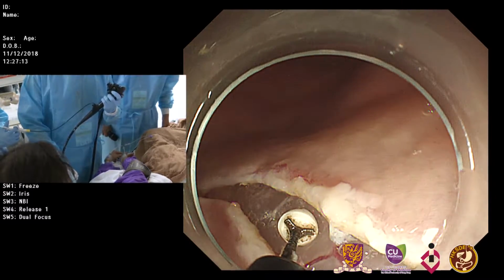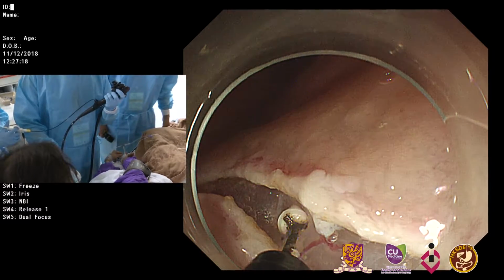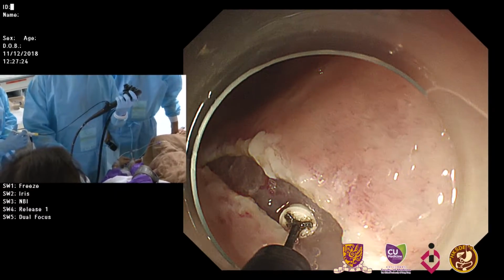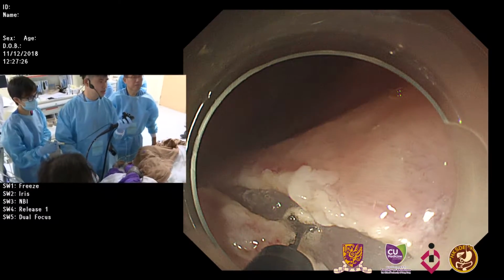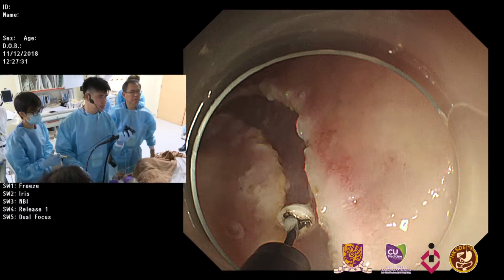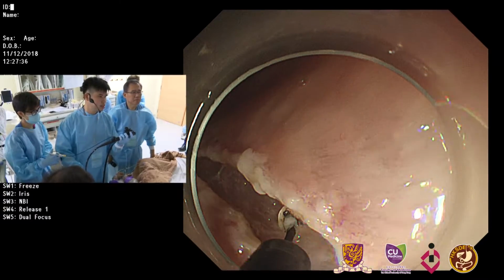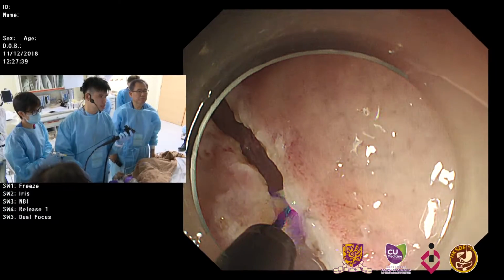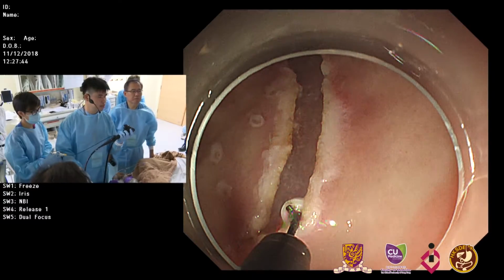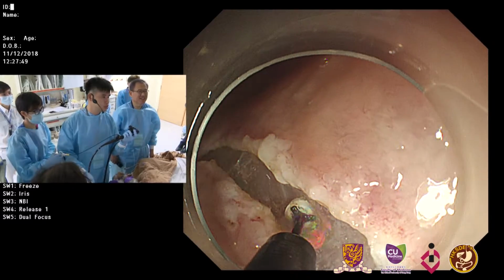Would you have considered using one knife, like a dual knife only? Yeah, indeed, yes. It's probably more cost effective if you use only one knife. But to me, I use both, because if you use the IT2 in the stomach, when you cut deeper, you'll find that it's quicker. One method to reduce the cost is that during the initial mucosal incision, you only use a needle knife, but not the commercially available ESD special knives. Then you can save the cost of using 2 knives.